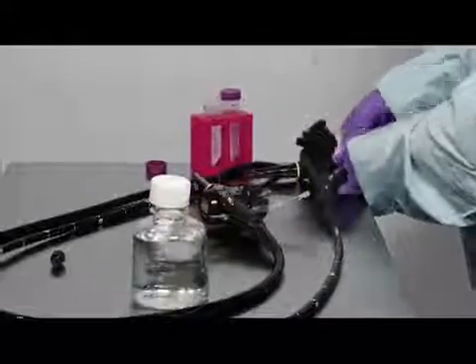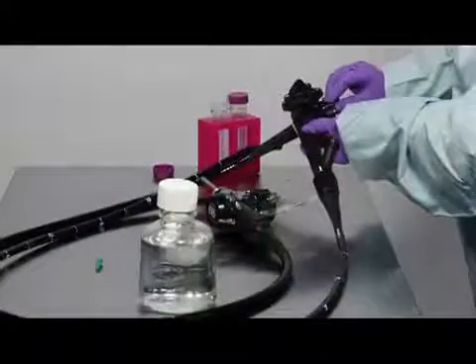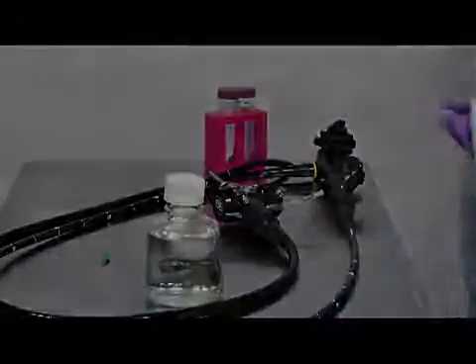We do recommend that you go with the first protocol rather than the alternate protocol, just because it's actually easier once you get used to it, and you don't have so many parts to take care of. You always want to cap your sample after it's taken to avoid any problems with spillage.